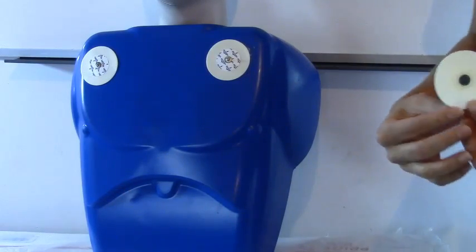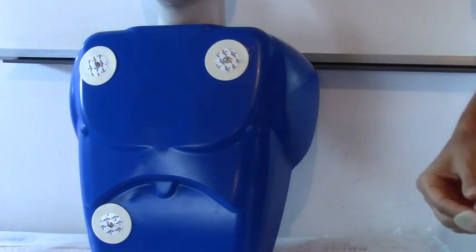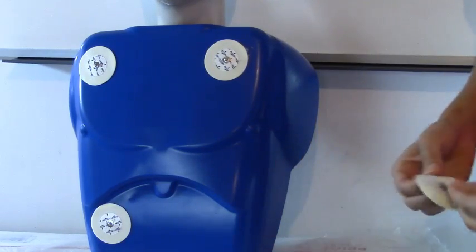And then we're going to go to the left arm lead. So we're going to go in the left upper quadrant for that area as well.